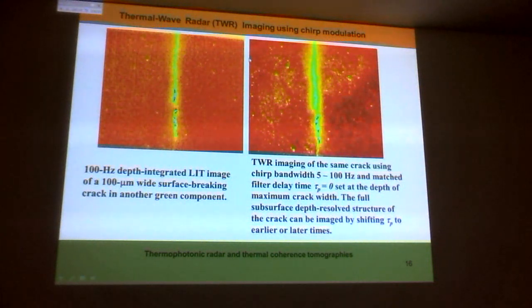We use that for our single-ended dental diagnostic. We don't take the camera down to low temperatures, but the signals are so strong that I don't have to. I still see a signal in there. But most of the time, I think, yeah, this is the thermal component of the camera.